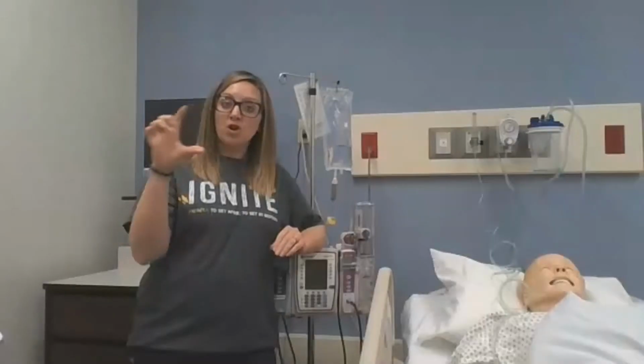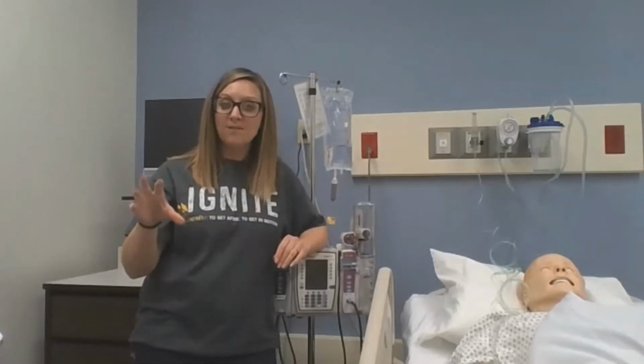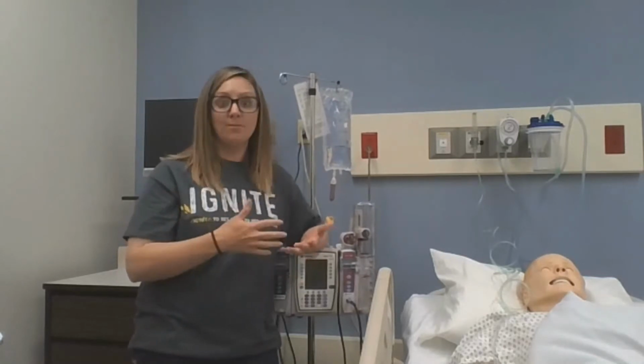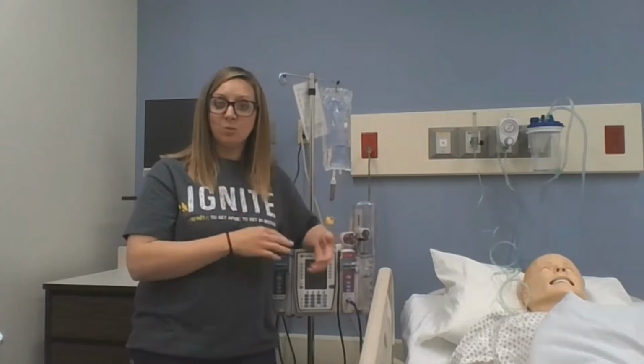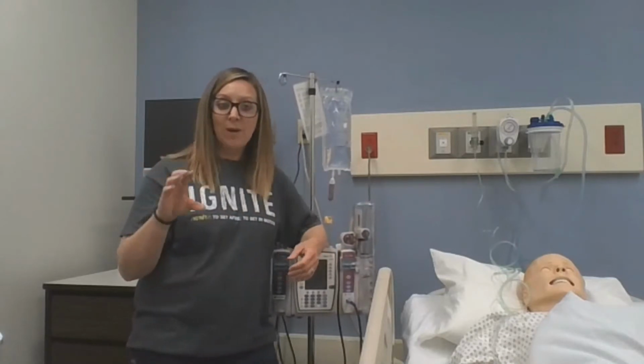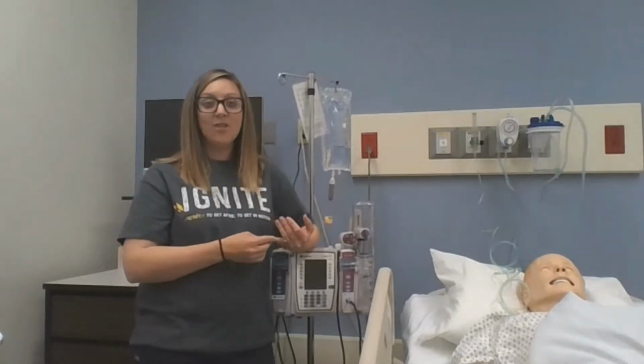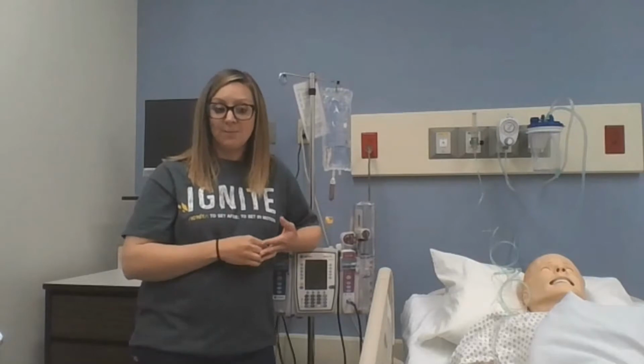And then in the order set, they tell us hover to discover in Cerner, right? So you're going to hover over the nursing text order. And this is part of the nursing communication orders. So this isn't something that flows through for pharmacy on the medication order, whether it's morphine or Dilaudid or whatever the drug is. It'll be up in the nursing text for the power plan. And it basically says that the patients can't be on any other sedatives. That's our policy for the hospital.